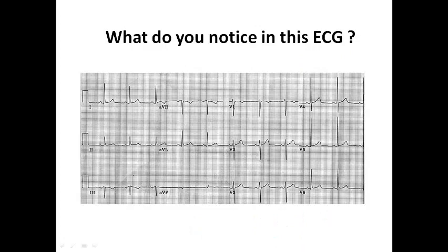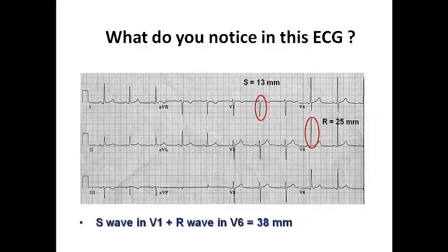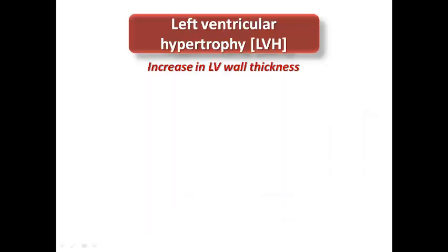Looking at this ECG example, we can see a deep S-wave of about 13 mm and a tall R-wave in V5 of about 25 mm. If we calculate the sum of the S-wave in V1 and the R-wave in V6, it would be 38 mm, which is a large number exceeding 35 mm.